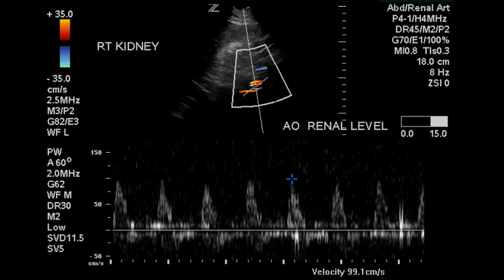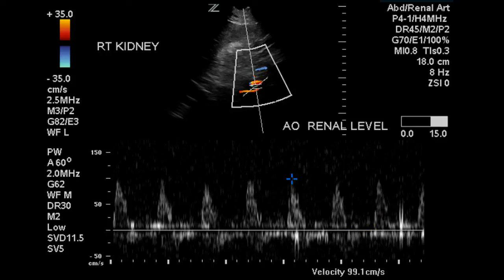Here is the velocity of the aorta in the area of the renal artery origins. It is monophasic, which is what it should be, and the peak systolic velocity is 99.1 centimeters per second. So none of the velocity measurements in the right renal artery exceed three and a half times the peak systolic velocity of the aorta.